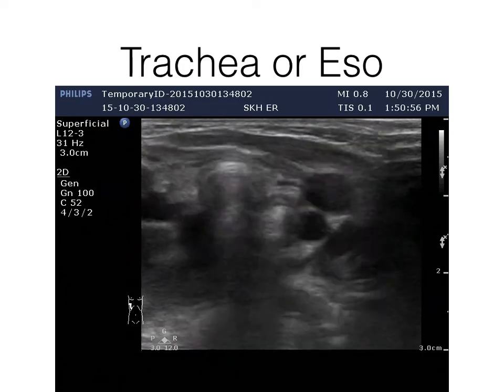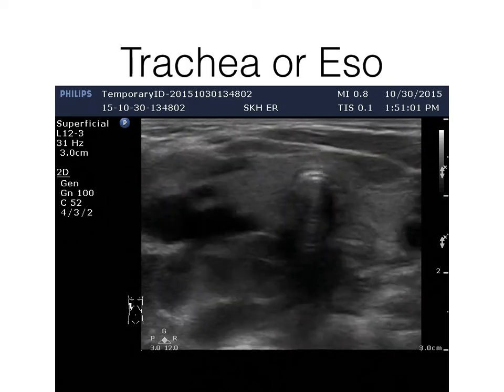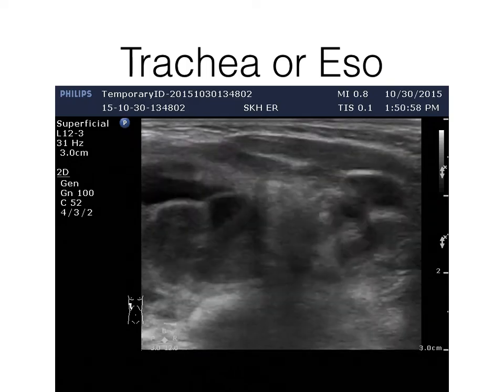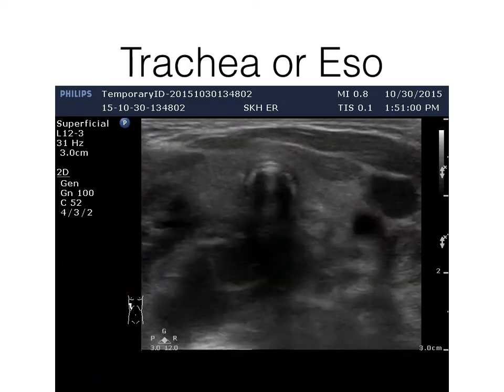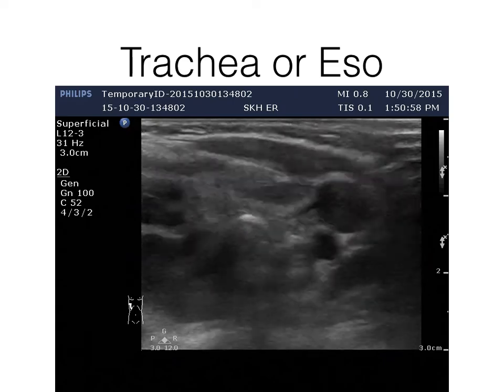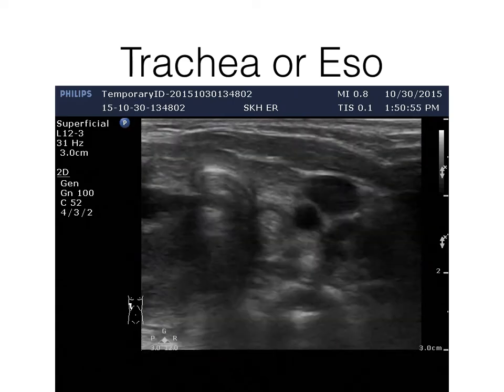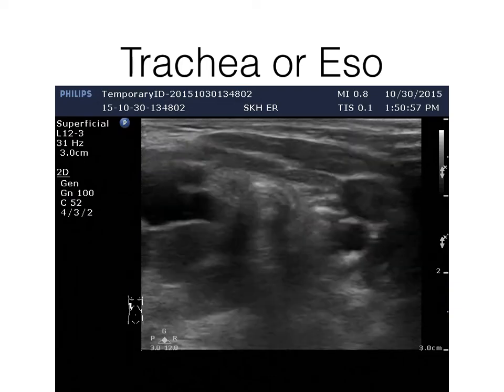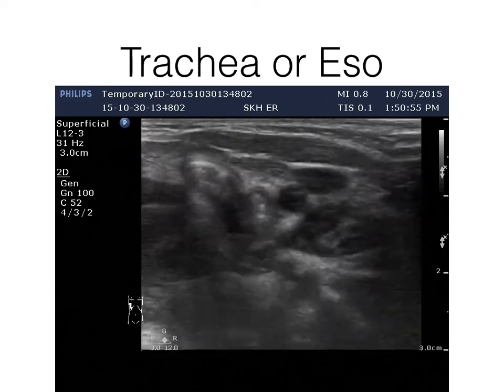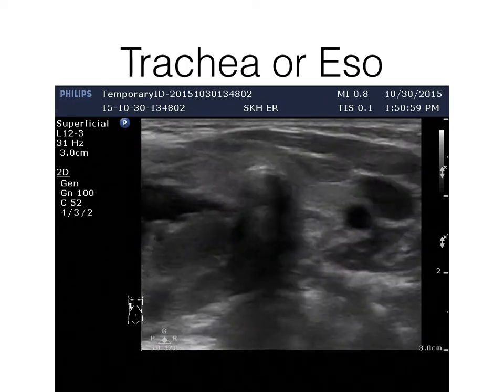Correct position? Correct. The patient is not paralyzed, so still struggling breathing. Right? So we cannot see double track. Some air here, you can see this because of the swallowing air instead of the air track consistently appearing. So this time we did a great job.